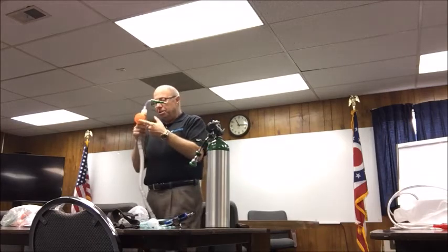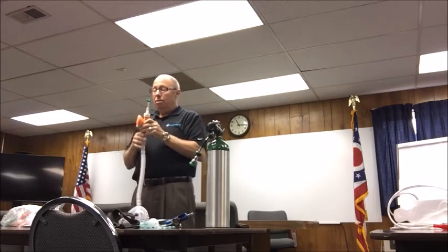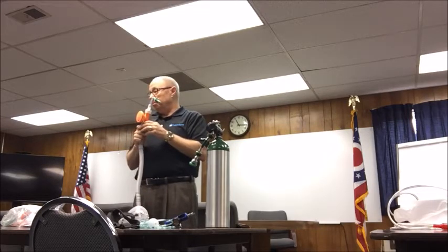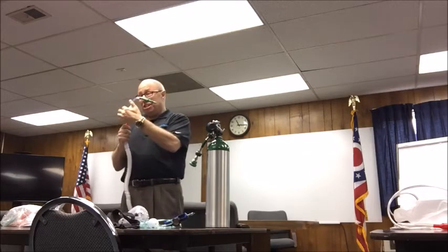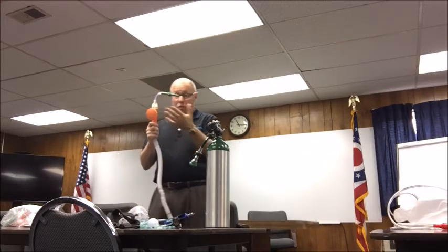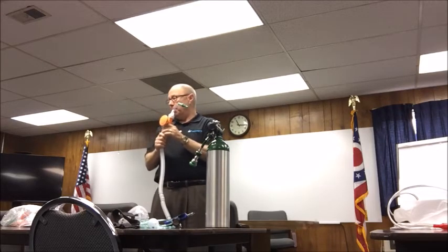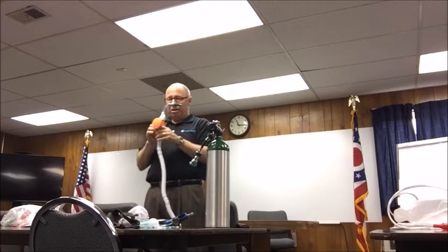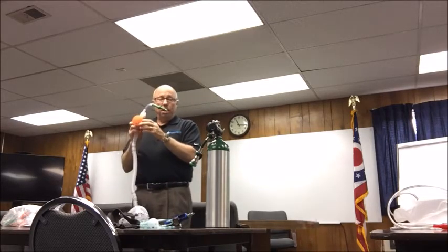One of the other advantages of this system, this is a closed system. This is a 99.999% bacterial and viral filter. So if you've got bad bacteria or viruses out there, it's going to stop it from blowing down into the patient's lungs, which are already compromised. Okay, it's not going to stop everything, but it will stop the majority. It's got a higher bacterial and viral filtration rate than a HEPA filter. So it's a good system.